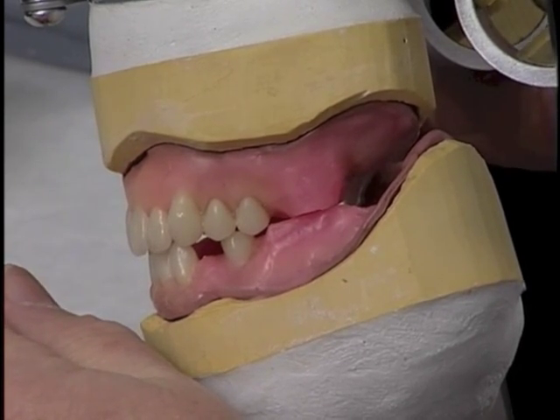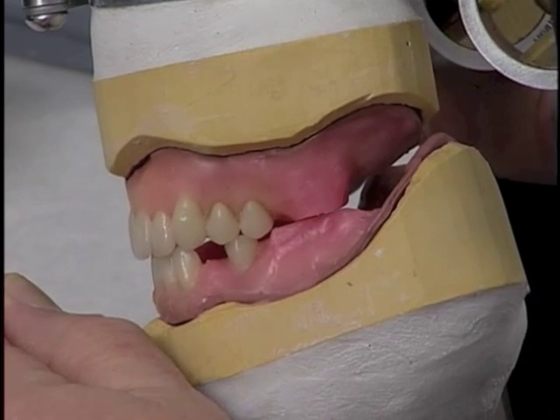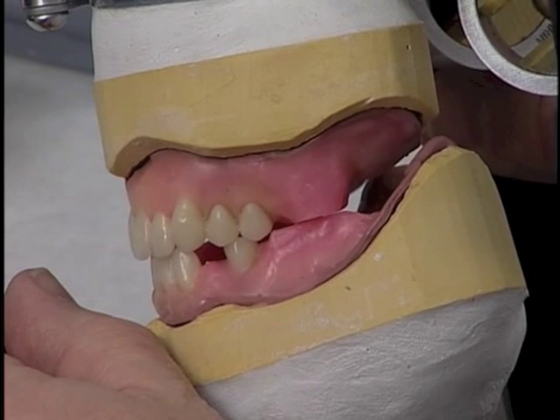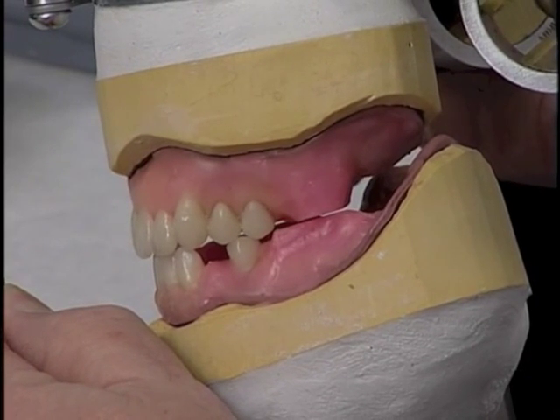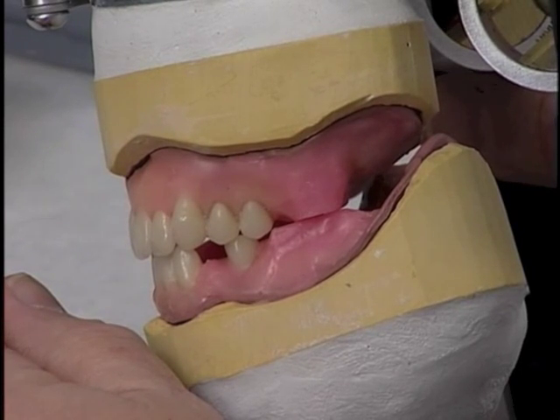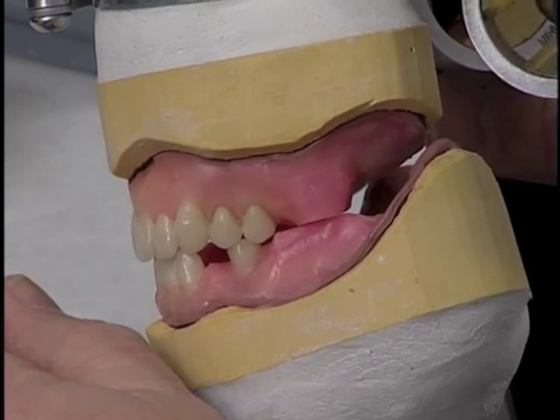When we move the mandible into left working position, as we're doing here, we'll see that we can maintain contact of the mesial slope of the mandibular second premolar with the distal slope of the maxillary first premolar, and we also at the same time have contact of the distal slope of the mandibular second premolar with the mesial slope of the maxillary second premolar.